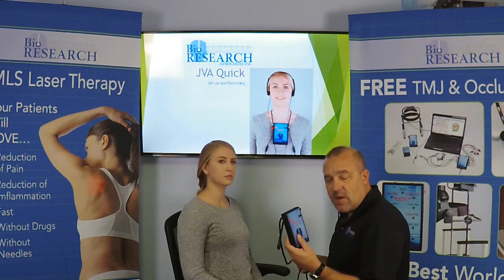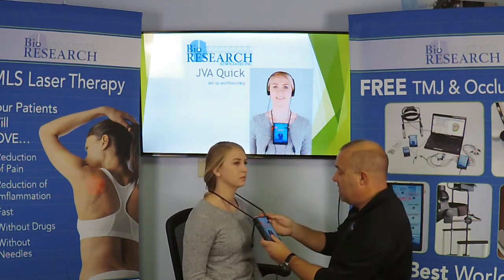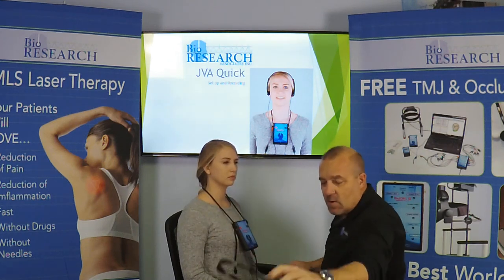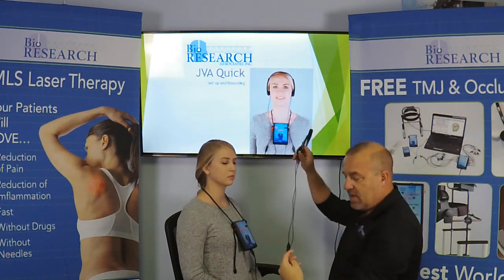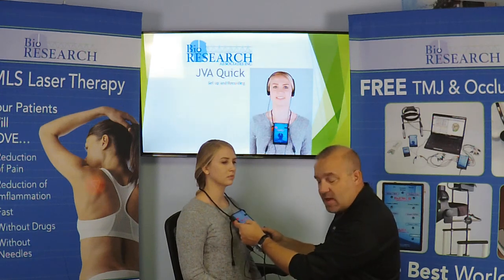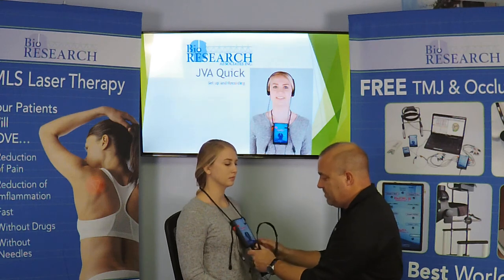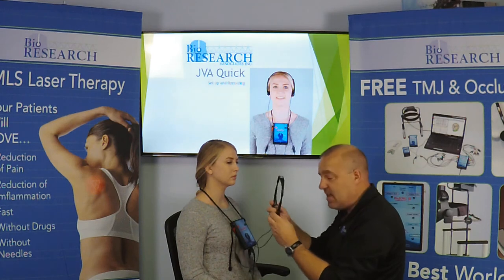So to place the joint vibration analysis system on the patient, we have this little neck band here. Just put it around the patient's neck, let it hang loosely. You can tighten it here, bring it up a little closer if you'd like. We take our JVA headset, keeping in mind that the right sensor is the one with the red plug. We'll plug that in to the port. If you have the EMG3, joint vibration analysis inlet ports are on the bottom of the amplifier. If you're using JVA USB like I am here, they're on the top. So we just go ahead and plug those in, making sure that we keep the right sensor on the patient's right side and the left sensor on the patient's left-hand side.